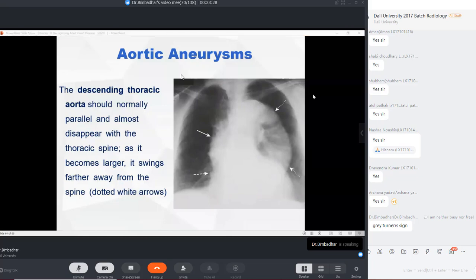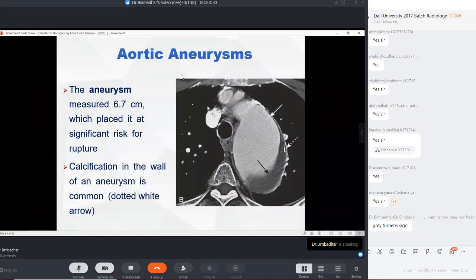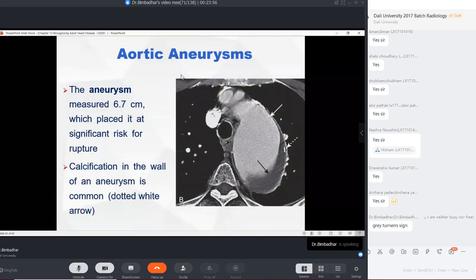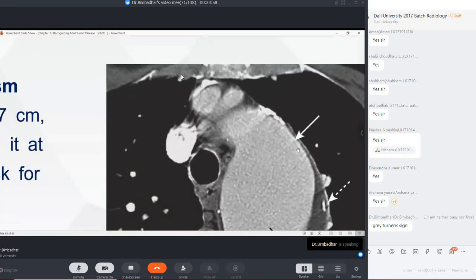Okay, right? This is not very important at this level. And like what we were talking about before, on a CT you see here, this is the normal lumen and this is the destroyed layer, and now there is eventual expansion and there is a filling up. So calcification, if I'm looking close enough along this layer, I'm saying atherosclerotic plaques are nothing but filling up of the calcification.